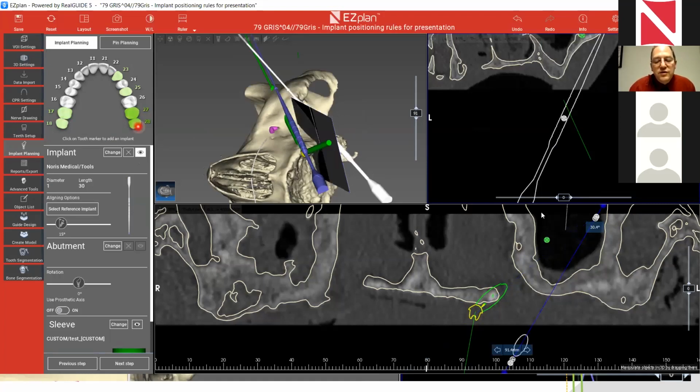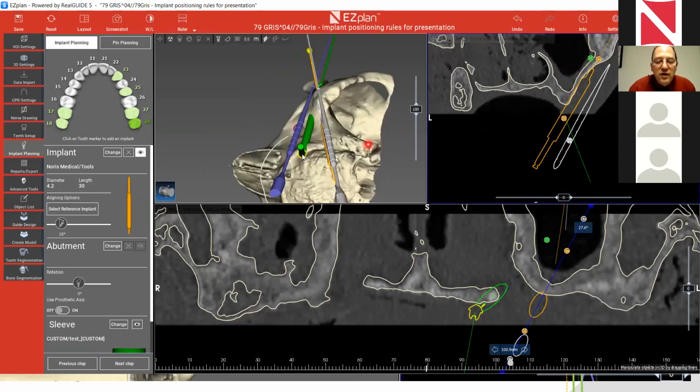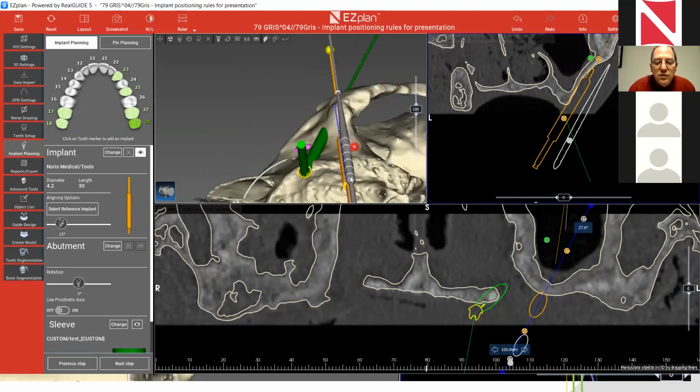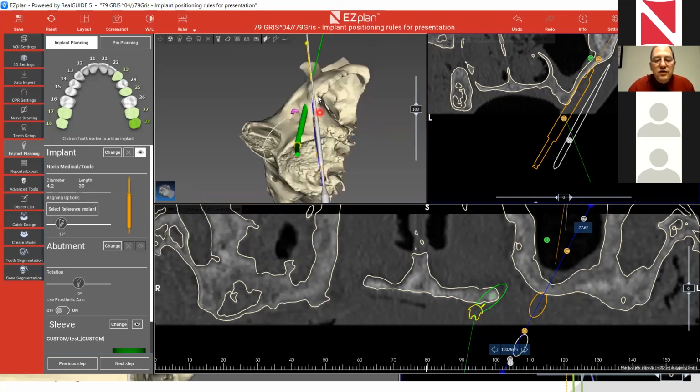I'll move this away. Again, we have to make sure that we are looking, as I explained before. Let me hide that. It's like we want to look this way. That's how we look. This way we look. We see the temporal fossa here, and that's where we want to go. It's always going to be like that. Okay. And now what we need to do is first of all to see if you're going to be a crossing.